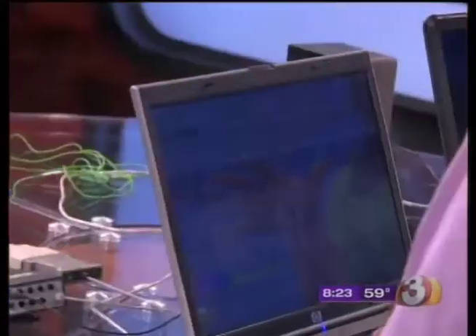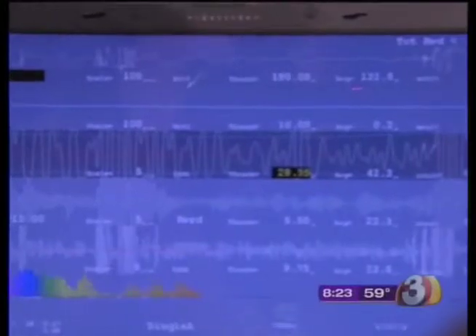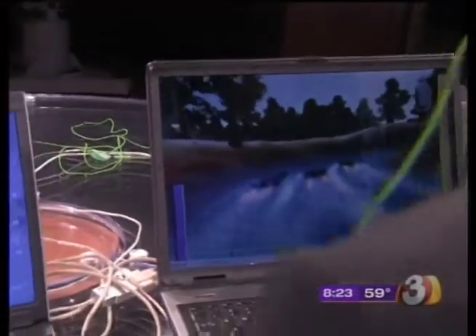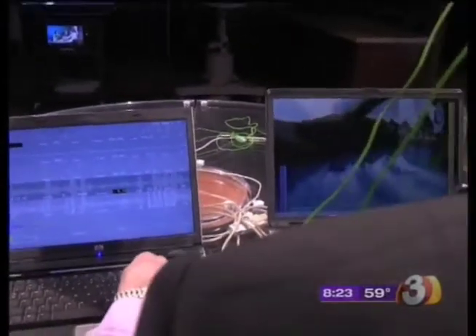And what are you seeing so far? And Bob, by the way, has a shot over your shoulder here to give folks at home. Bob, are you able to see you're recording brain waves here? Yes, exactly. So it's measuring his brain activity at the front of his head here and teaching him how to control these boats here. And he's controlling these boats with his brain? Exactly. His focusing, yes. Wow. That's impressive. I did not know that. We haven't wrecked yet.